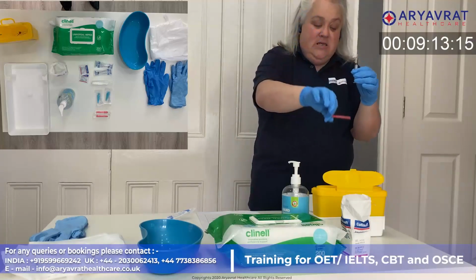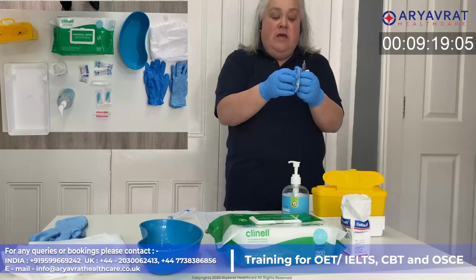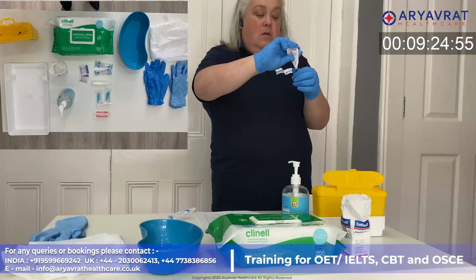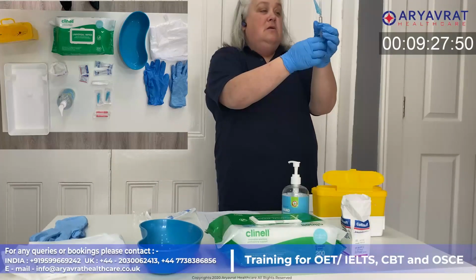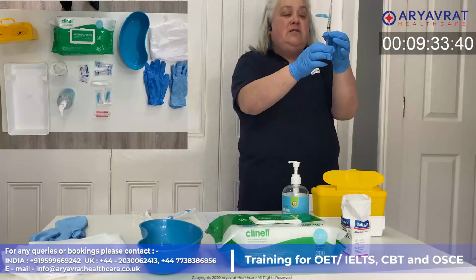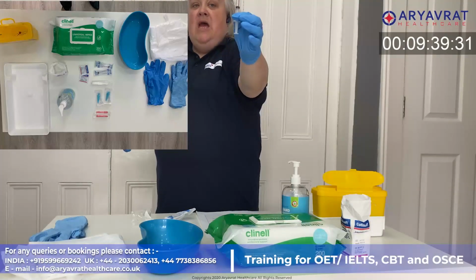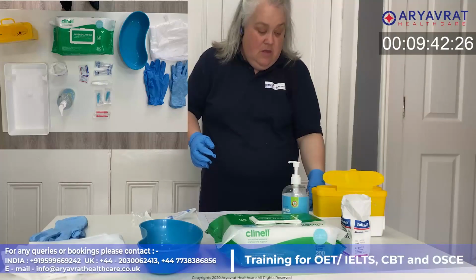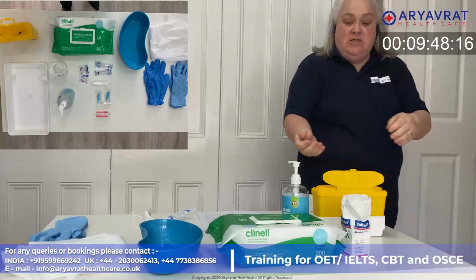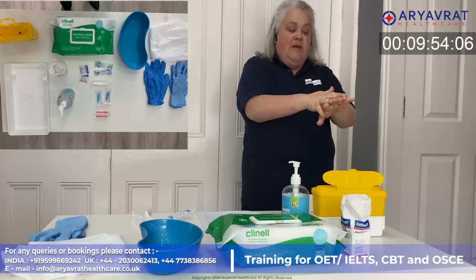I am going to take this needle off and discard it directly into the Sharps bin, and I'm going to open my administering needle and make sure it is fine. I will then show my examiner that I have 1 ml with no air bubbles and I'm ready to give my medication. So I'm going to remove these gloves and do my hand hygiene one more time and take the equipment, the injection, to my patient's bedside.